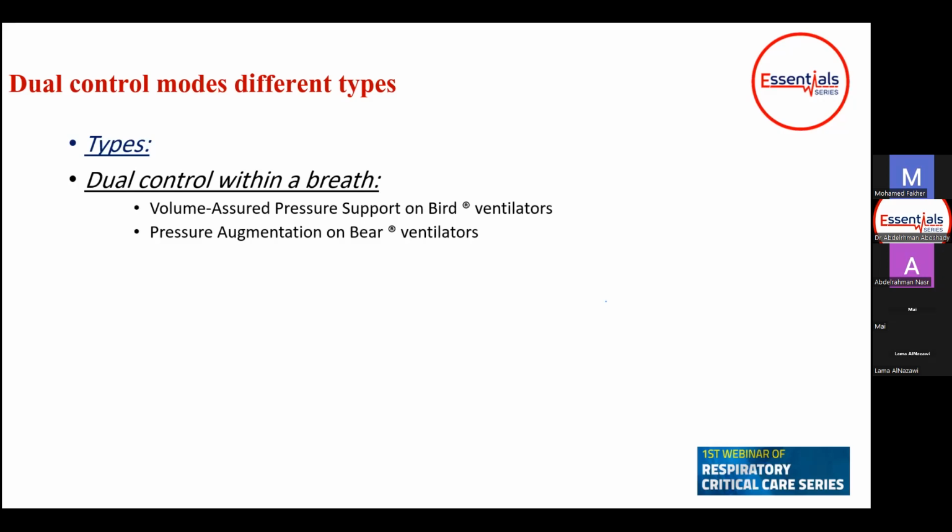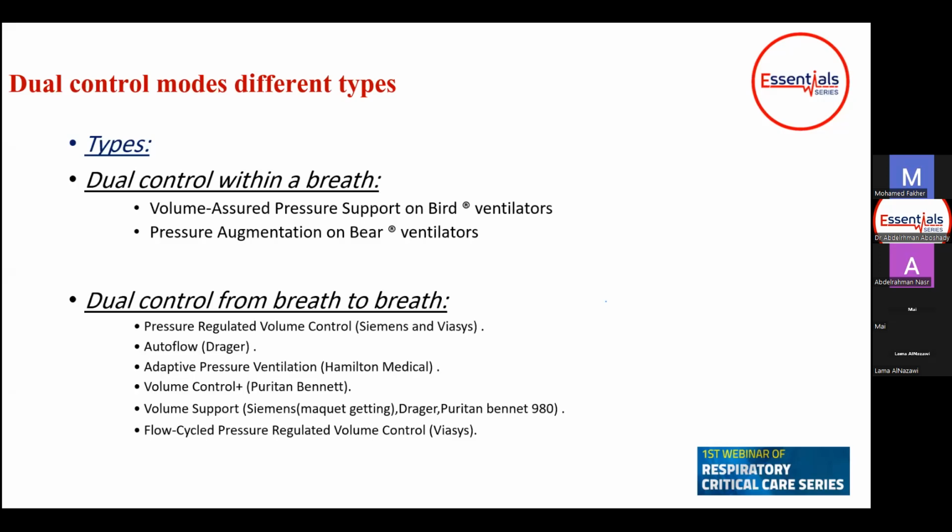Actually, we don't have Bird ventilators in Egypt, so we don't use VAPS anymore. It was available in 2004 and 2005, but I don't think they are available commercially in Egypt nowadays. Neither Bird nor Bear.